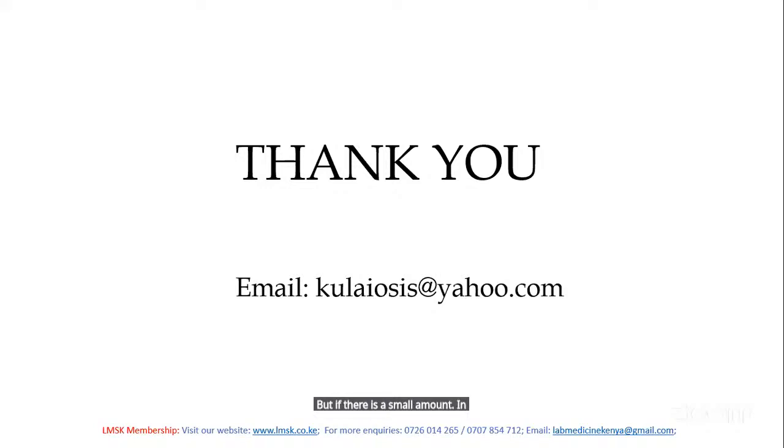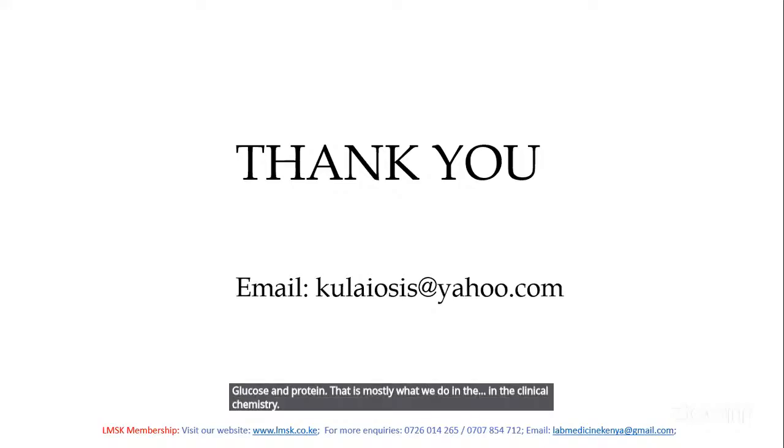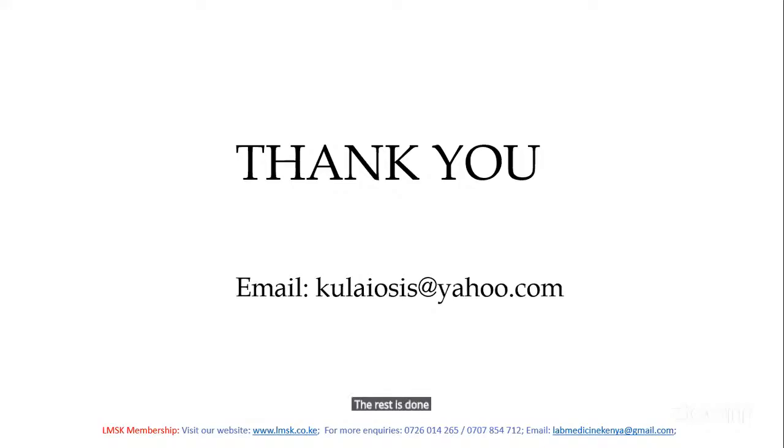in clinical chemistry, kindly do what you can. Like in clinical chemistry with the CSF, mostly we do the sugars, glucose, and protein. That is mostly what we do in the clinical chemistry. The rest is done in some other sections, bacteriology and others. So if you can do some few tests, the better.